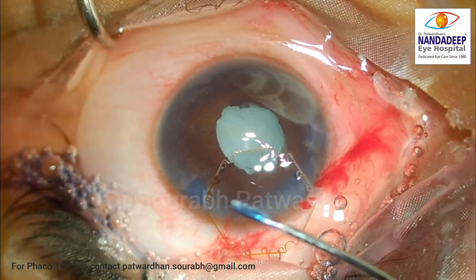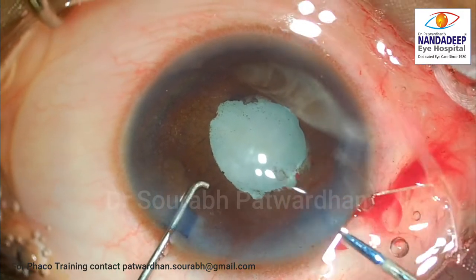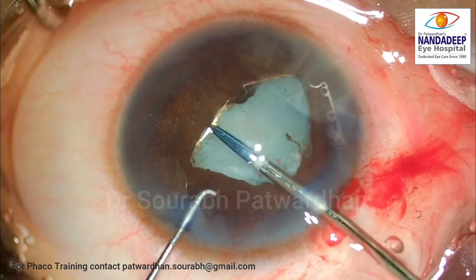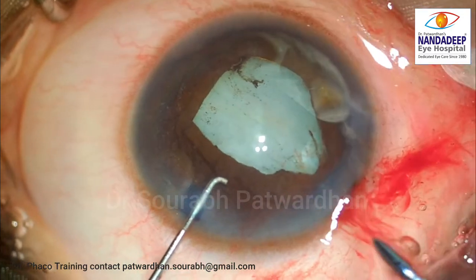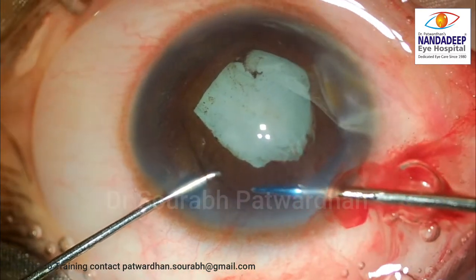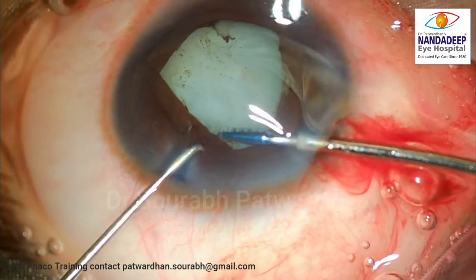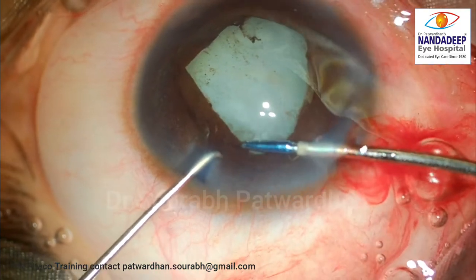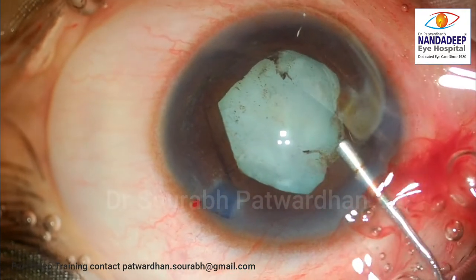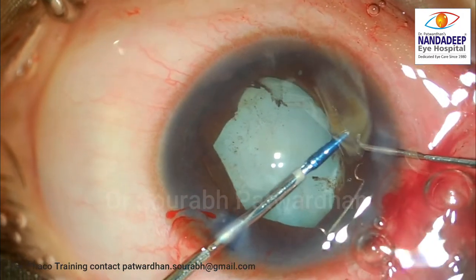I decided that I need a larger pupil size, and the best device for such a shallow anterior chamber is the B-hex pupillary expansion device. It's a hexagonal device made up of nitinol, very easy to insert. This is a special 23-gauge curved forceps which comes for insertion of this device. Because it is a very shallow anterior chamber with very minimal working distance between endothelium and anterior lens surface, I am finding it a little bit tough to maneuver the B-hex ring. It is important to make those flanges go underneath the iris so that it hooks the iris at six places and keeps the pupil dilated to around 5.5 mm.